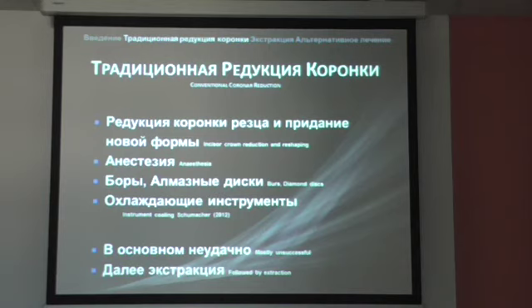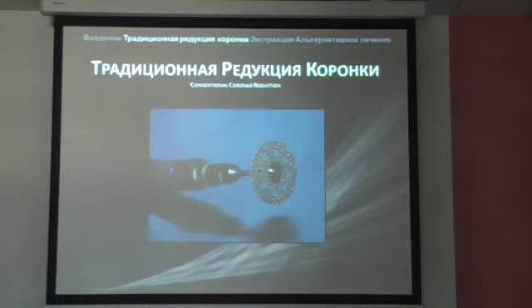However, this technique is in most cases unsuccessful, and it's mostly followed by extraction. So we use these diamond discs.